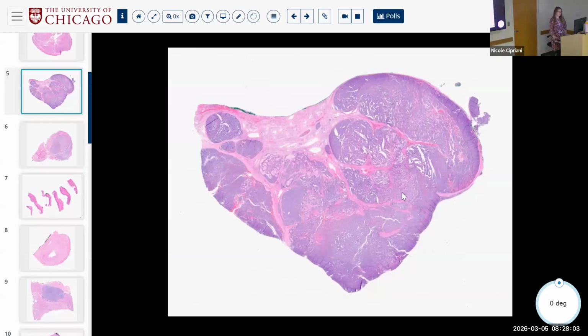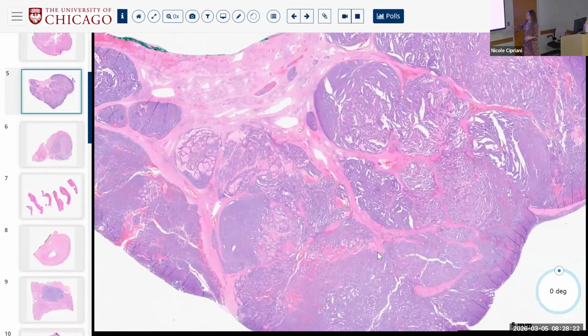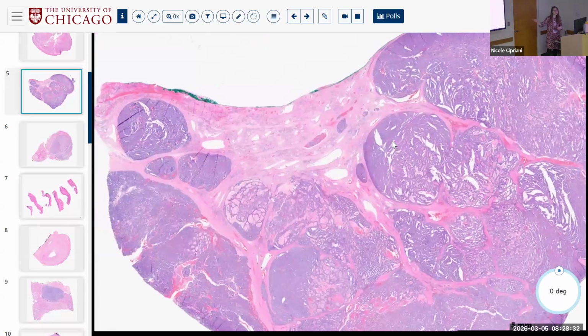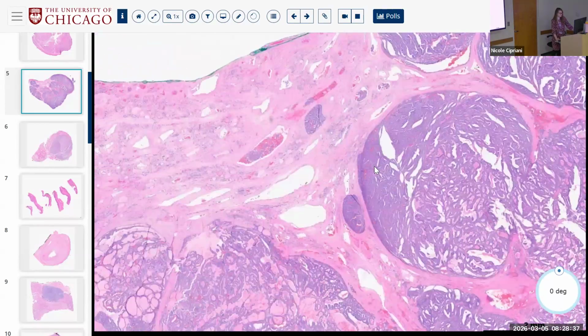All right, next case, benign or malignant. Malignant, right? You can look at this on 1X on the slide and be like, that's really purple. That's no good, right? Really, really purple for thyroid, no good. Multiple satellite nodules of invasion, lots of internal fibrous bands, not just one capsule, right? But intersecting, small satellite nodules, malignant, right? Excellent. Many diagnoses of thyroid carcinoma are low power malignant, which is why I think the virtual slides are really helpful, okay? So multiple satellite nodules.